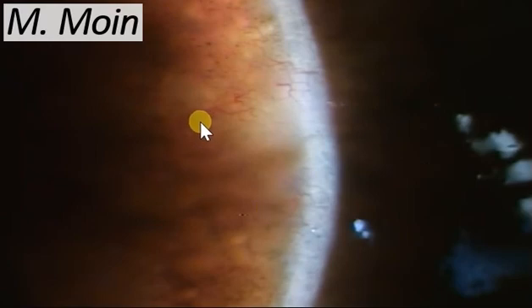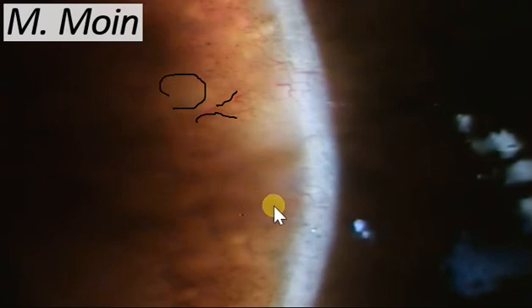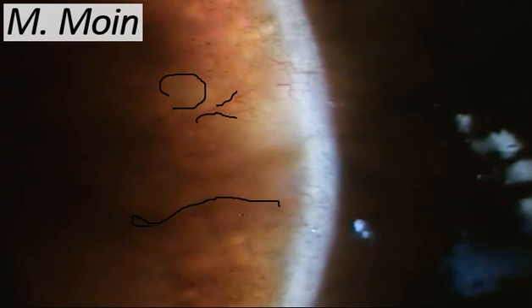First you look at diffuse illumination, then you do a slit beam examination to see the structure of the lesion. Here at higher magnification you can see these telangiectatic vessels pretty easily, along with the clear cystic spaces and the pigmented areas present in these patients.